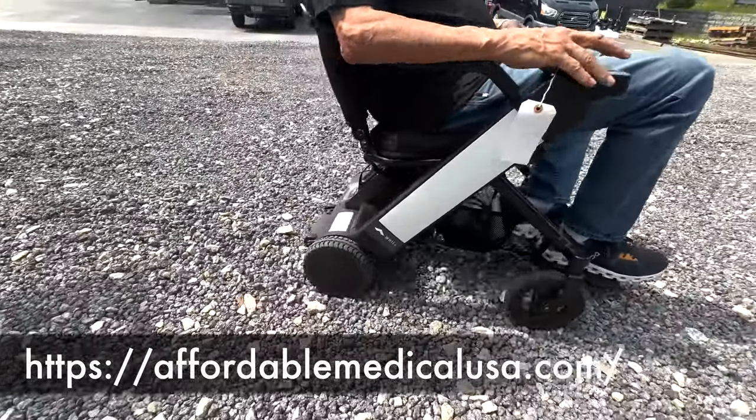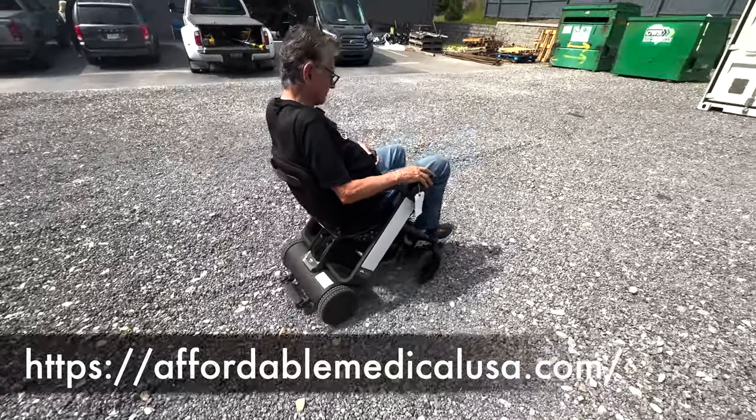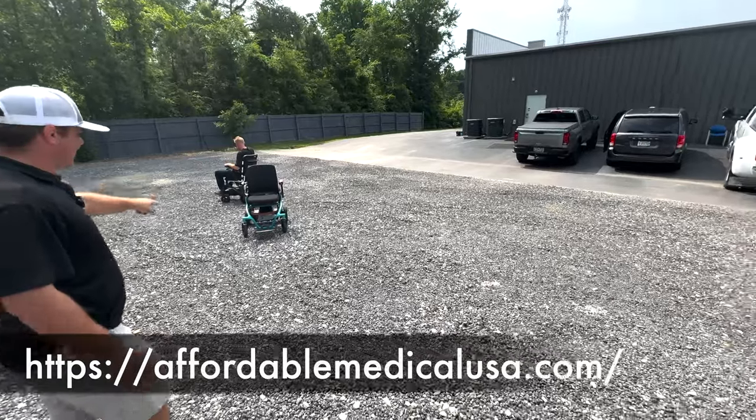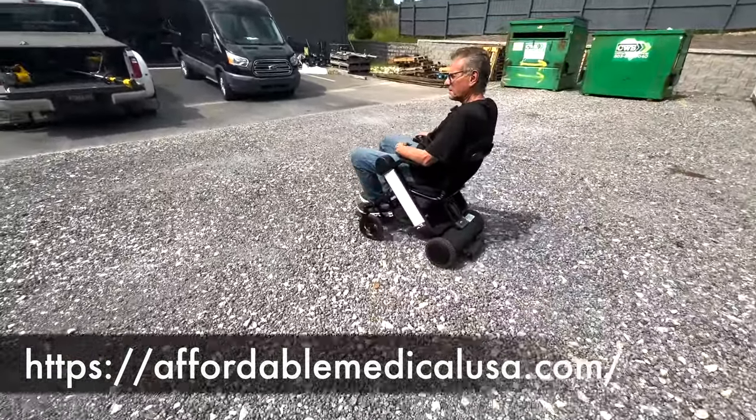If you keep turning it, it's going to make it harder. Those little wheels at the front are thin. On both of the carbon and the FI, they're a little bit thicker than on this one, so that's why it probably does a little bit better through here.